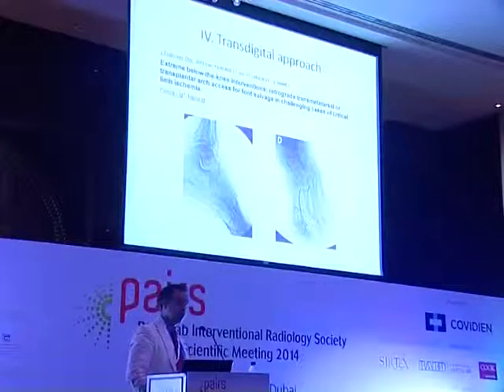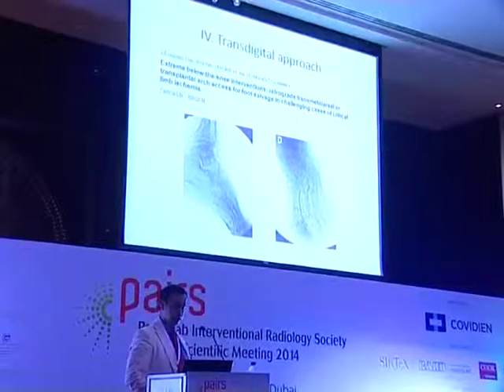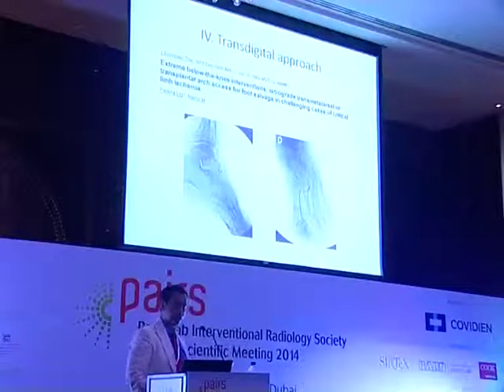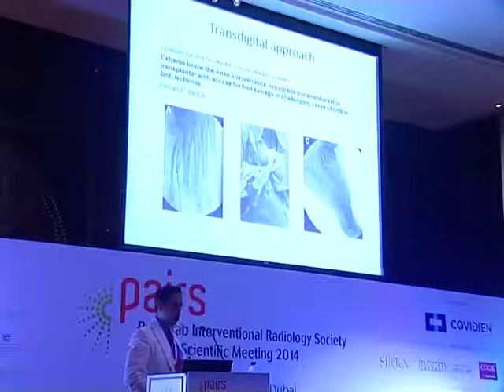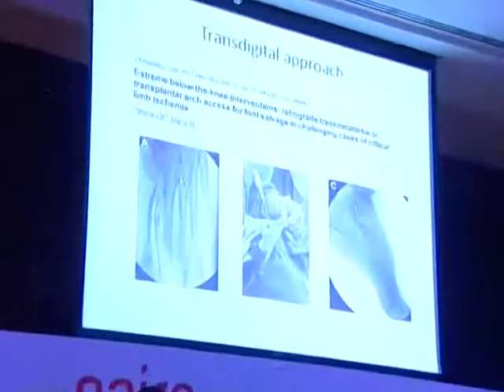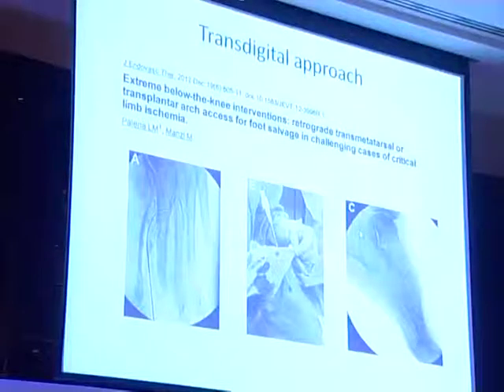Just to finish, I'd like to show you also a case from the literature. Our colleague, Dr. Manzi, showed us a few months ago that we can also puncture the digital arteries from the pedal access, like here, and he called it extreme below the knee intervention. We can see here the wire through this metatarsal artery going through the plantar arch. Here you can see the 3 French introducer sheath with the meeting of the 2 wires from antegrade and retrograde.